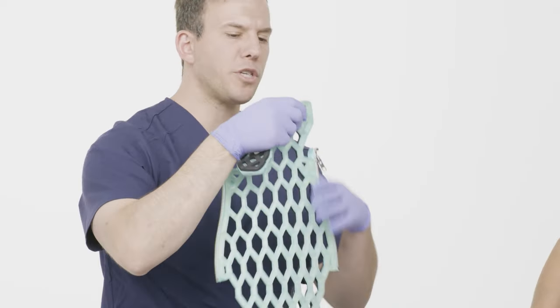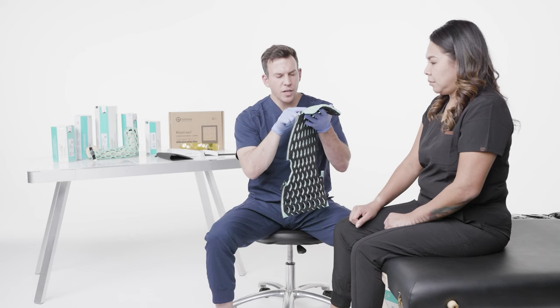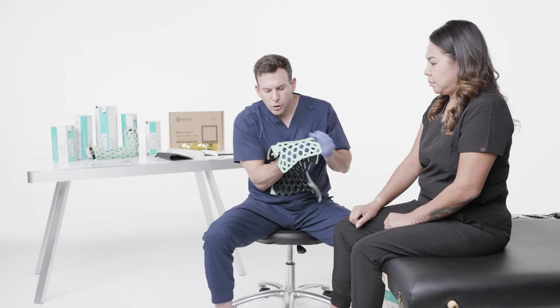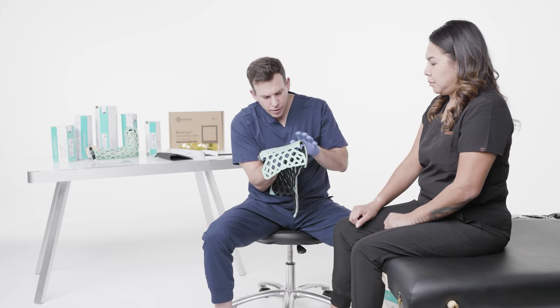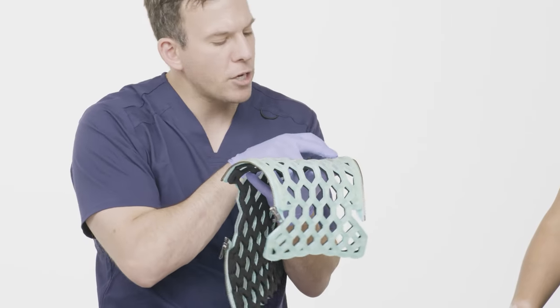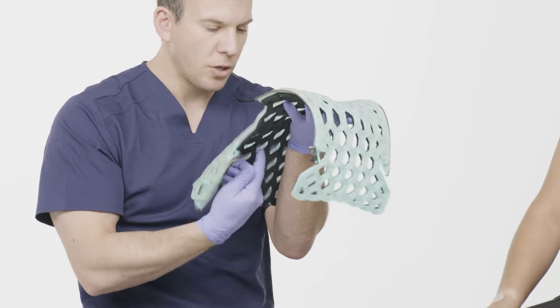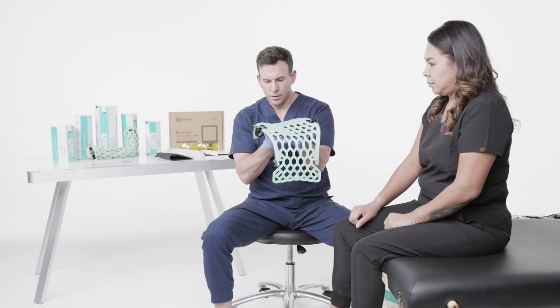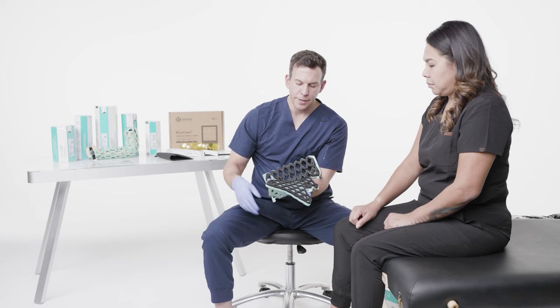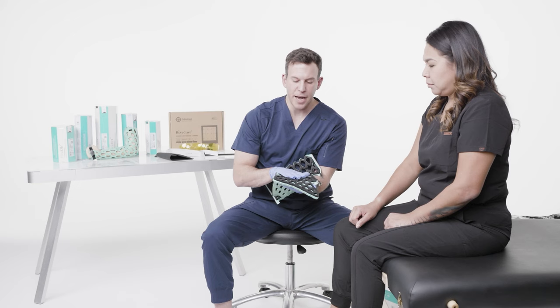Now I want to inspect and make sure that the silicone is not cracked and the resin is not leaking anywhere that could be harmful to the patient. If there are any cracks or any leakage of the resin out of the silicone, you can call the manufacturer and they'll send a new one. This looks good. You can also see on the deeper ends is where we have this rubber padding — this is what's going to keep the distance and protect the patient's skin.